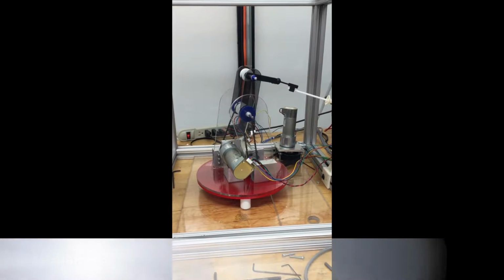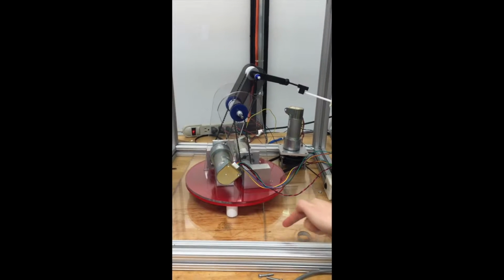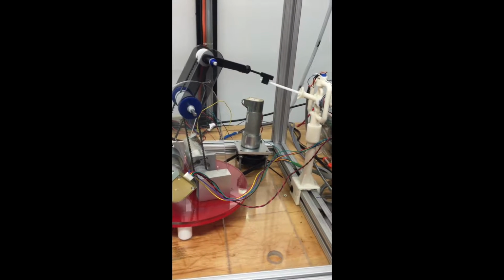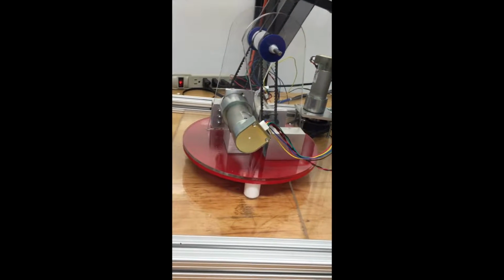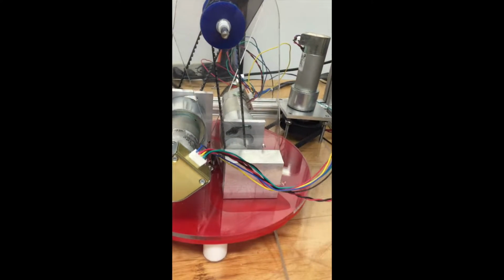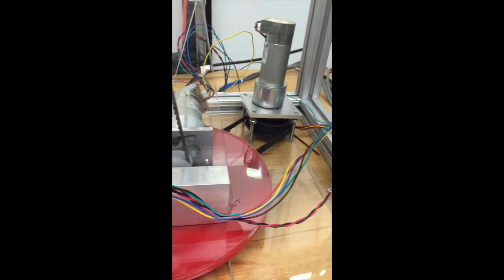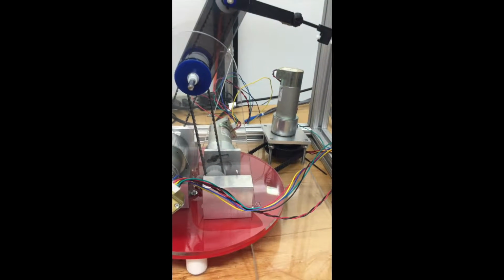The entire robot arm is supported by the base, which fits into the frame. A shaft sits on the X-axis centerline of the base plate, and a collar is press-fit around the shaft. A pulley is screwed in underneath the turntable, and a bearing is press-fit into the hole in the center of the pulley. A turntable pulley duo sits on top of the shaft. The robot arm achieves rotational motion about the Z-axis, which contributes to motion along the X-axis with its turntable, which acts as a revolute joint.